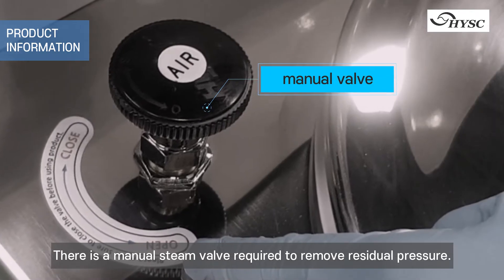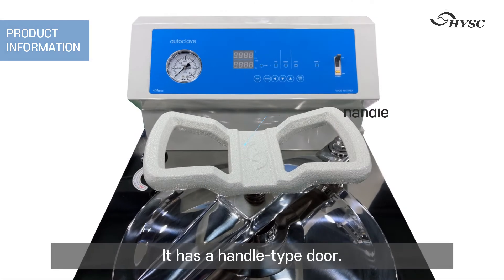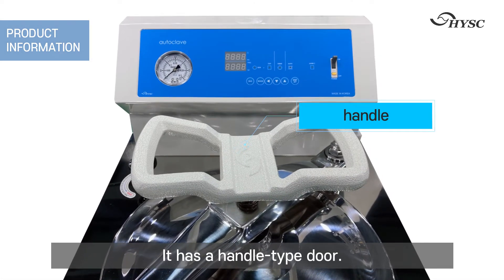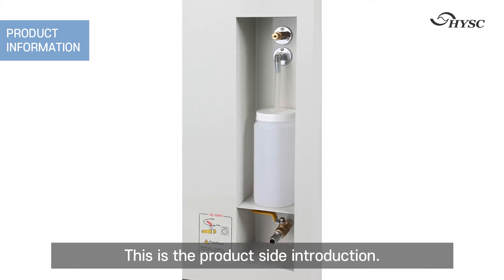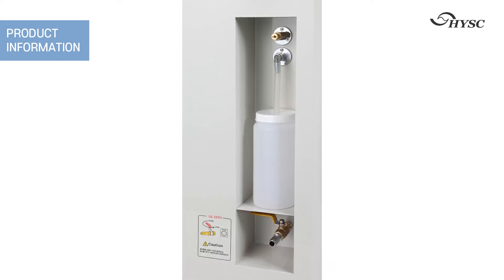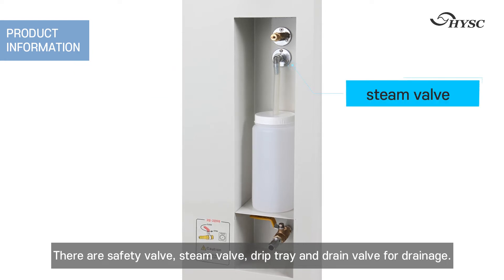There is a manual steam valve required to remove residual pressure. It has a handle-type door. On the product side, there are a safety valve, a steam valve, a drip tray, and a drain valve for drainage.